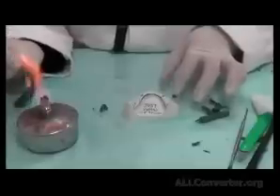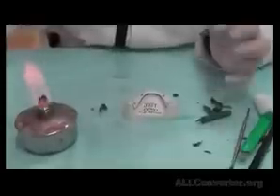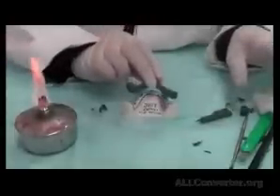The lingual pouch has a posterior part, middle part, and anterior part to it. Each part has a different instruction, so I'll put it in the patient's mouth.